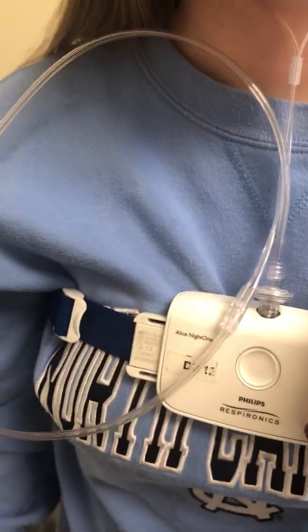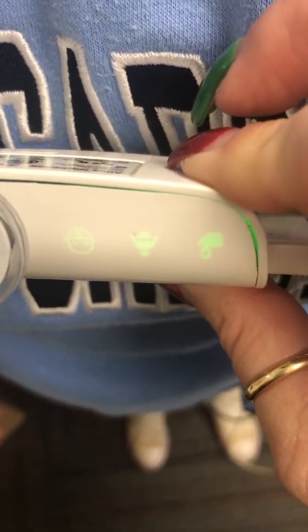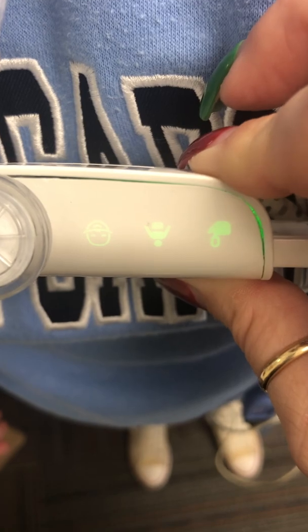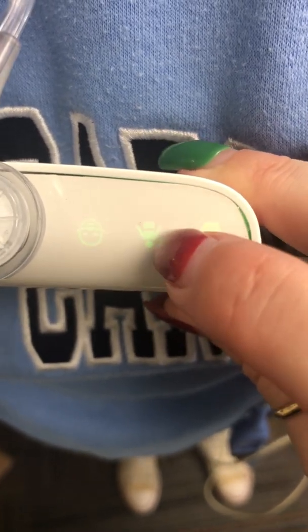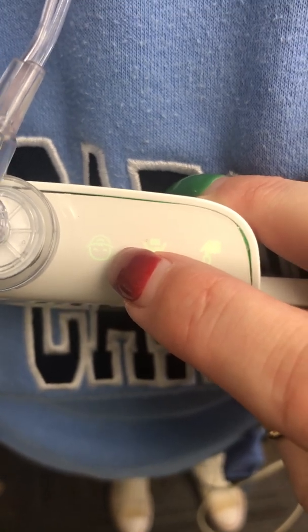Once all items have been placed, you will see lights. Those lights should all be green. If at any point a light shows yellow, simply ensure that portion is connected. The first light is for the finger probe, the second is for the belt, and the last one is for the nasal cannula.